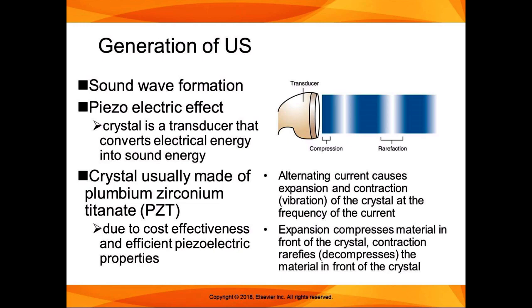So the sound wave is generated by applying alternating current, electrical current, to the crystal that's in the transducer of the ultrasound head. The crystal is made of a material that is said to have piezoelectric properties, meaning the electricity causes it to expand and contract as the alternating current vibrates.